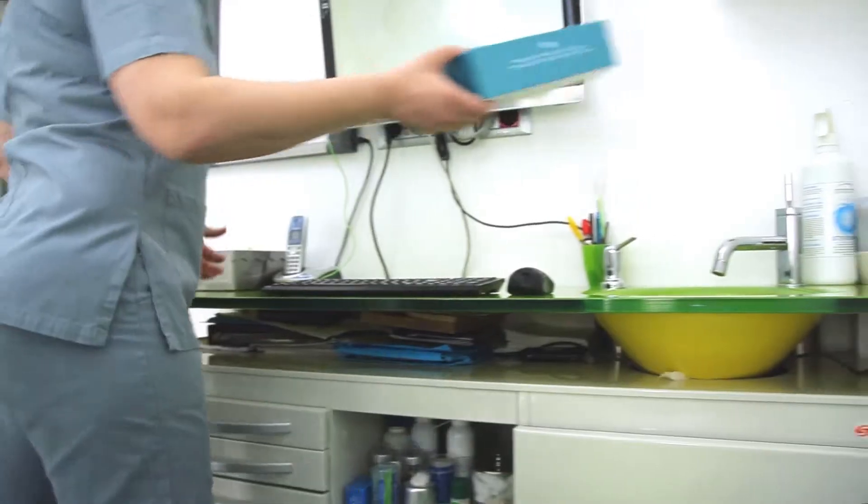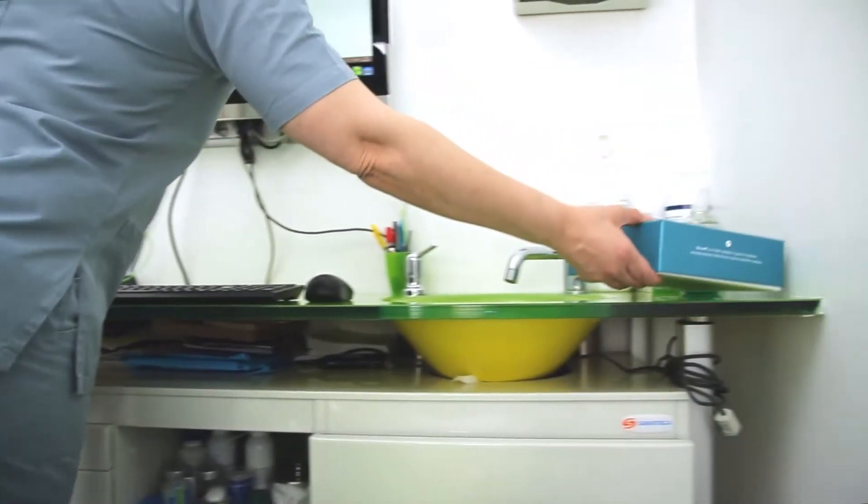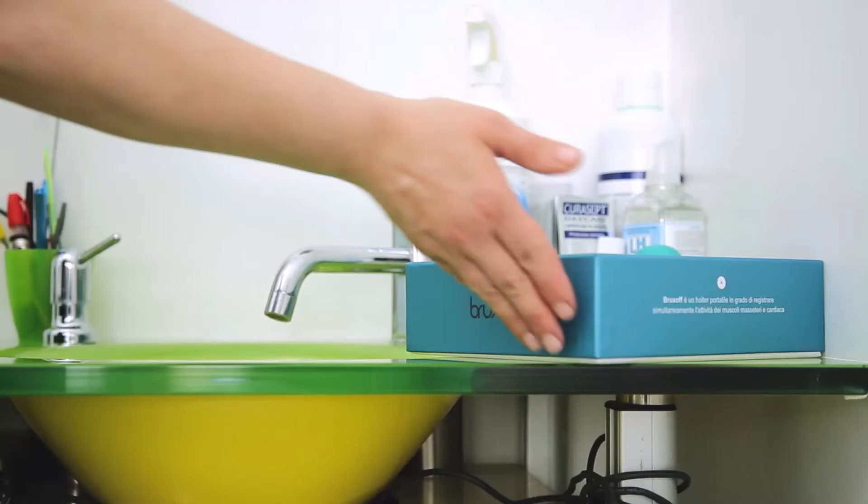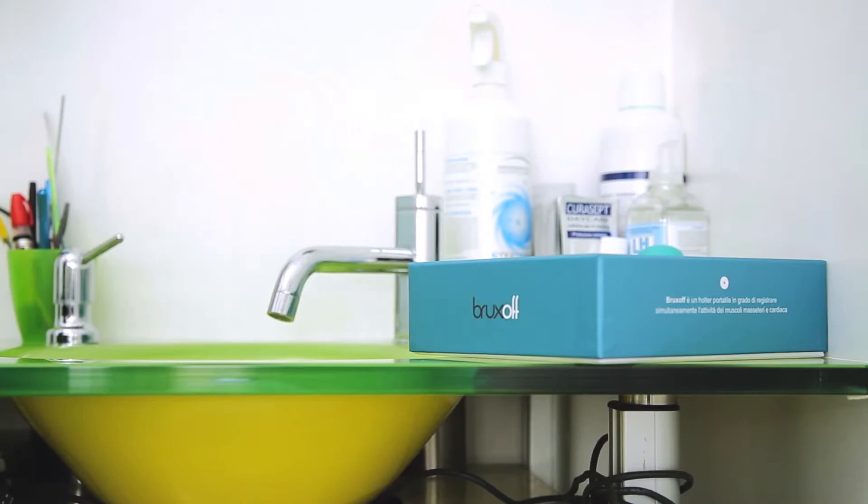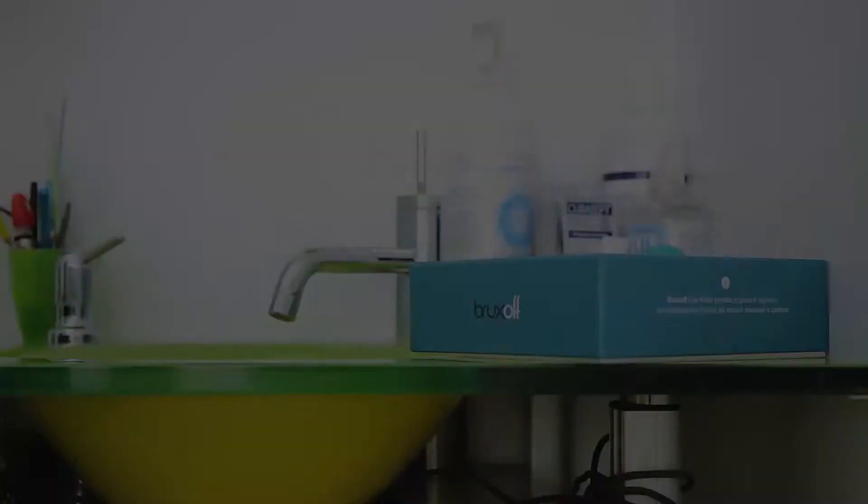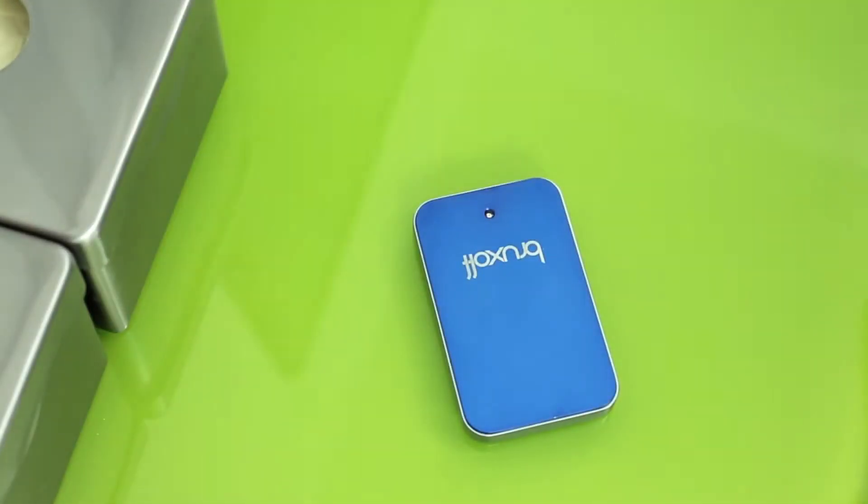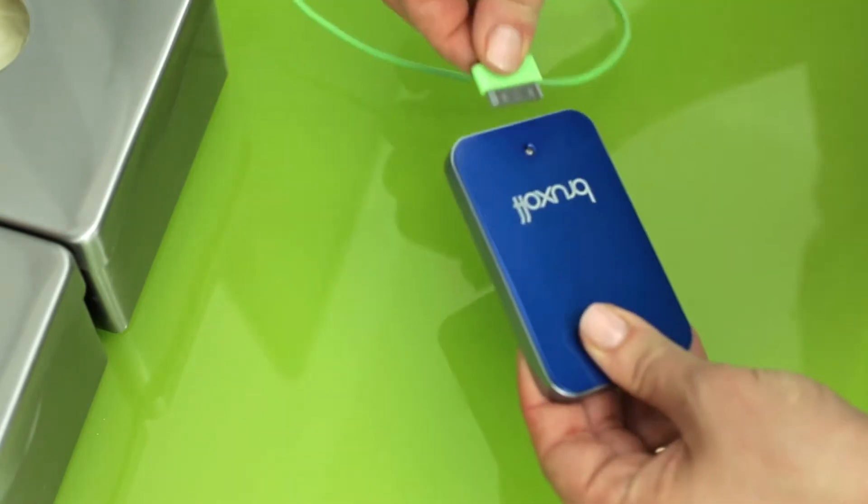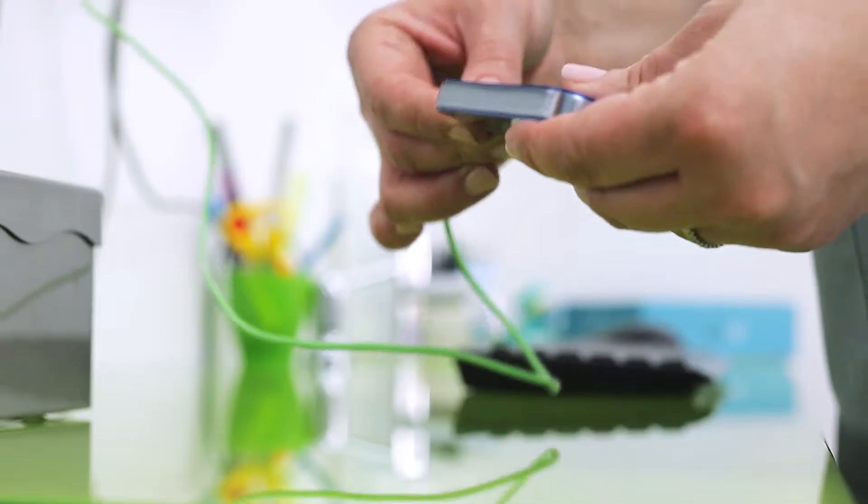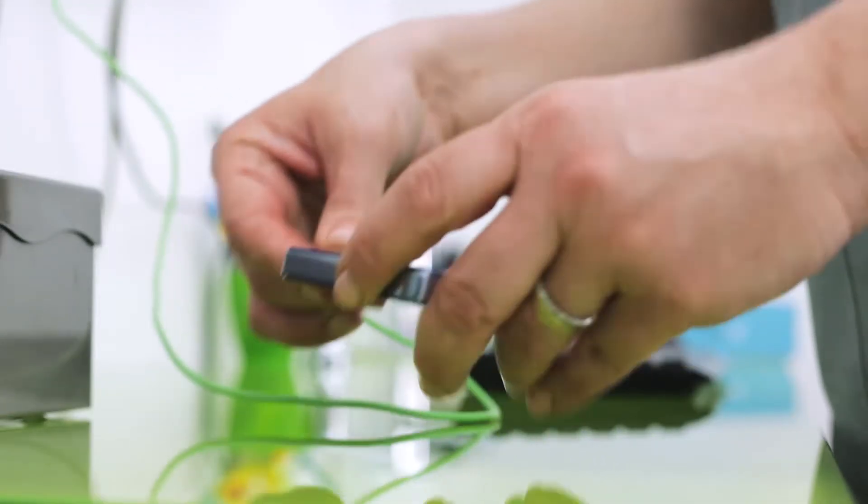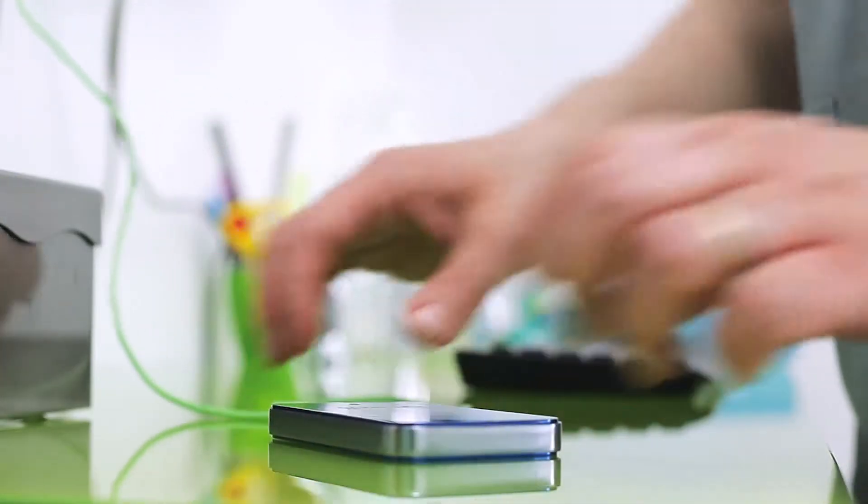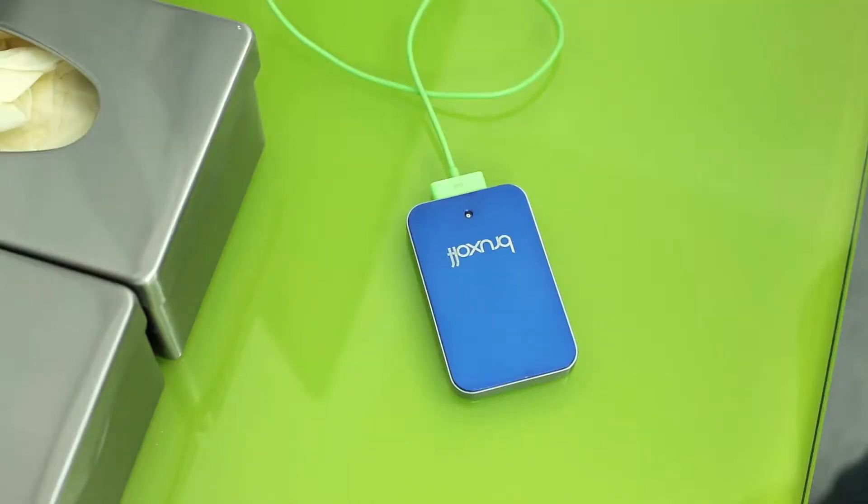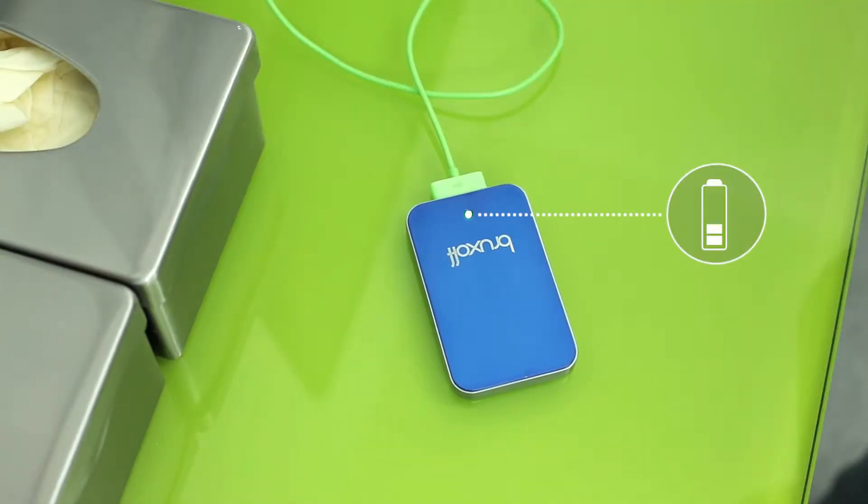At the end of the test, Bruxoff contains the data recorded by the patient during the night. To obtain the results of the test, use the special cable to connect the Bruxoff to a PC on which the Bruxmeter software has previously been installed. This also recharges the Bruxoff battery.